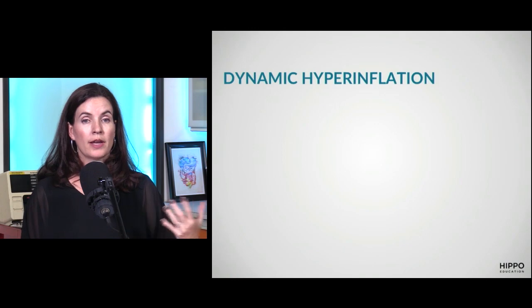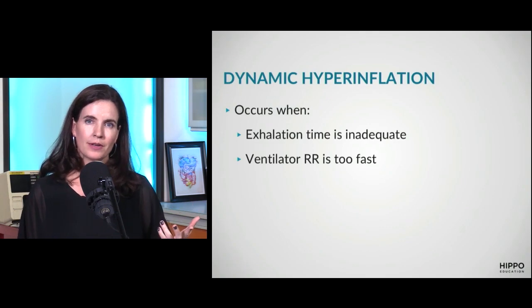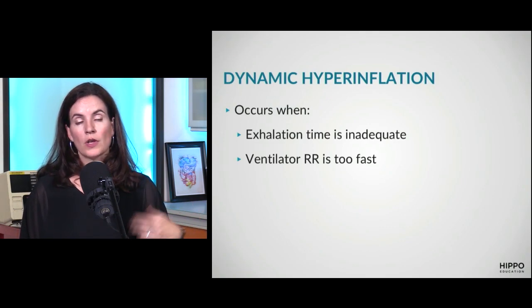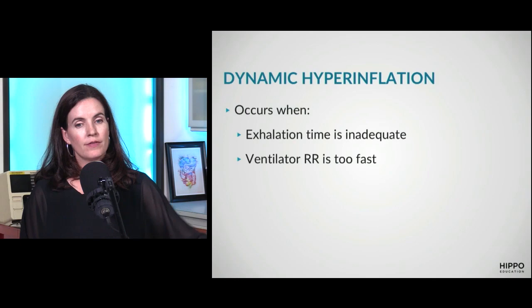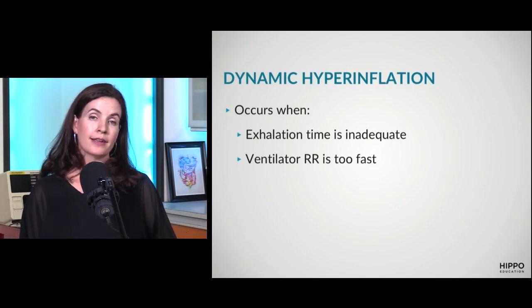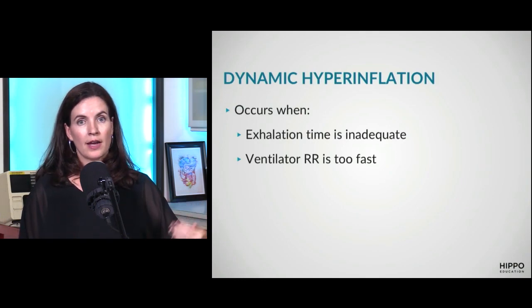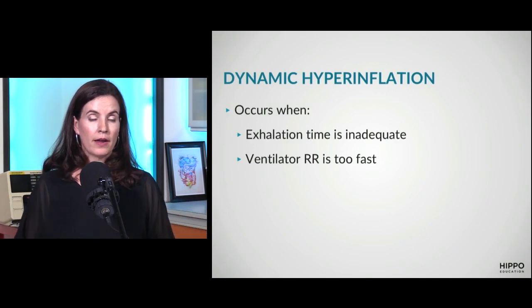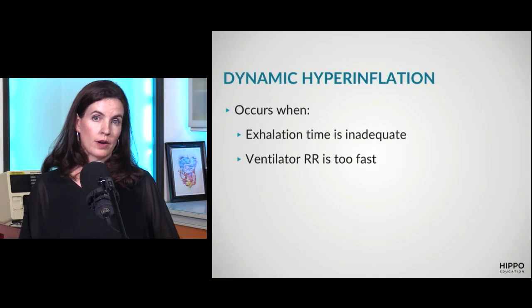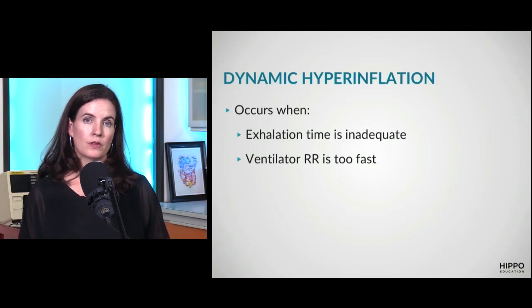This is also known as auto-PEEP, or breath stacking is the other term for it, and it can get confusing because there are so many terms. But this occurs when you have your COPD patient who needs a long time to exhale. And if the vent is blowing in air too fast, that exhalation time can be inadequate. They don't have as much time as they need to fully exhale and empty their lungs. And what happens is they have increasing breath stacking, their lungs expand and expand, the pressure gets higher until it impairs their venous return and can lead to poor cardiac output and, in fact, PEA arrest. And this is a special circumstance that we want to remember with these COPD patients.